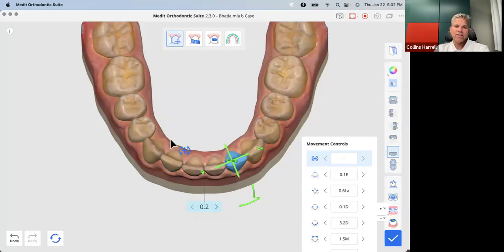But a patient who's had the braces off for a little while, those teeth aren't just going to move that easily. So that's why I'm thinking about just giving them a retainer that's made out of aligner material and let them wear that for a couple of months until we can finally get into a thicker retainer and see if we can continue to kind of force that tooth in. So a lot of different options on a very minor little relapse case, or a case where I've just taken off the braces and I want to just do a repositioning retainer basically, but I don't want to have to do it by cutting teeth off of a model.